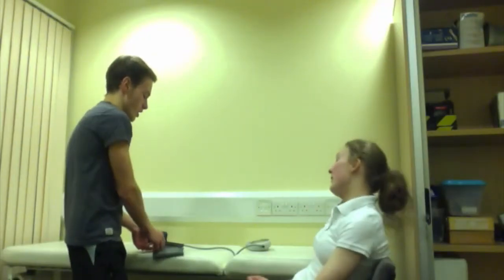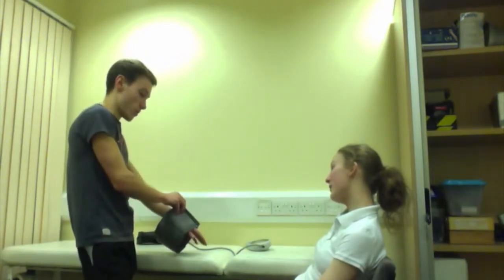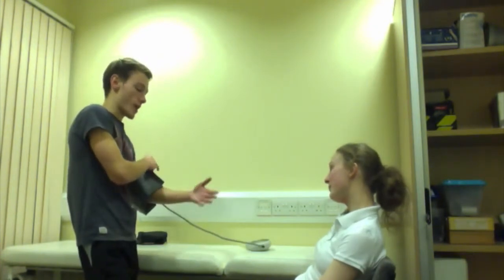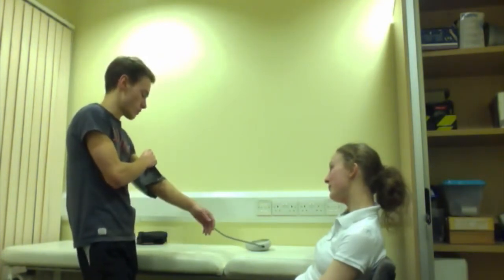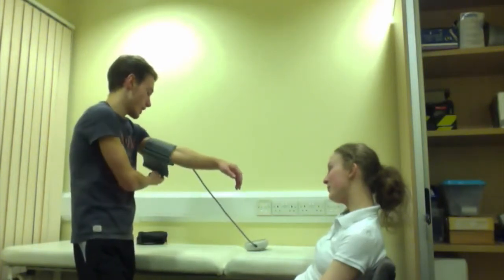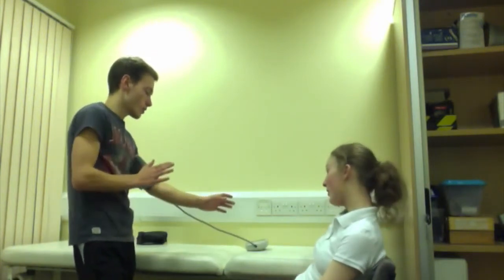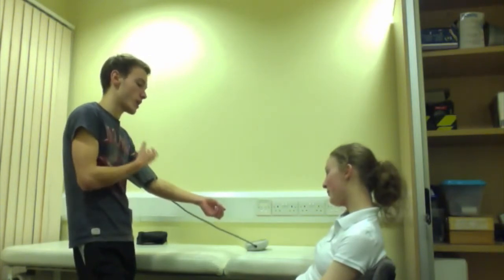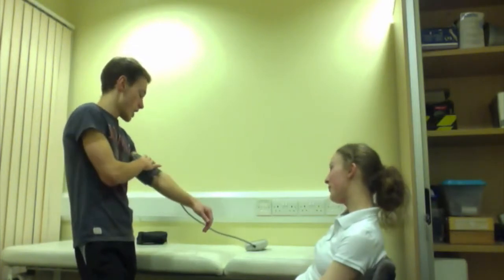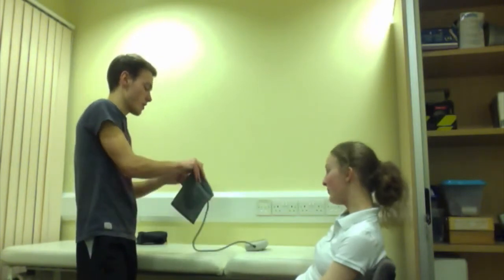Going on to blood pressure. I'm going to show you what to do but not activate it first. I'm going to pop the cuff on your left arm, slide it on and tighten it a little bit — not too tight — because it's going to inflate and get tighter. All I'm going to do is push the button for it to go, it'll start inflating and get a little tighter. If you feel discomfort, just say and I'll pull the strap off.